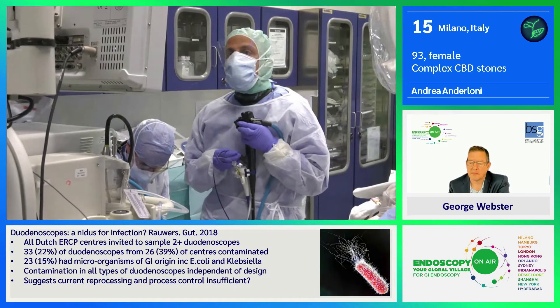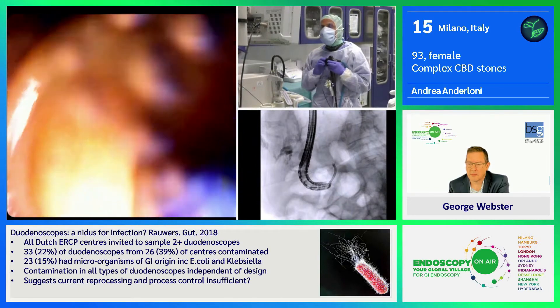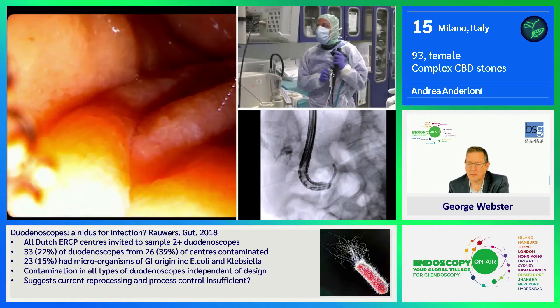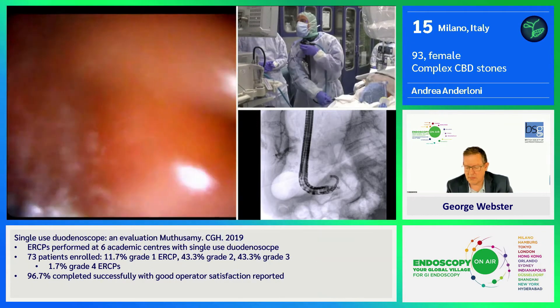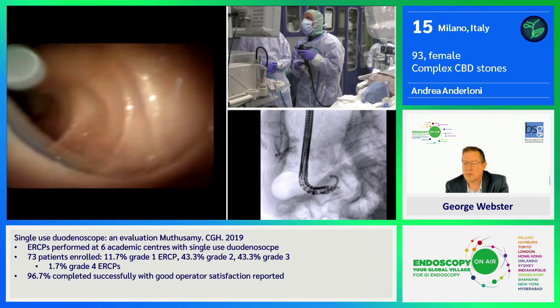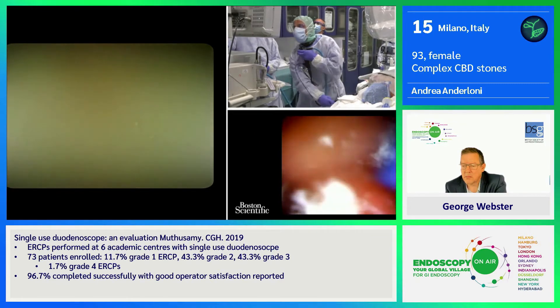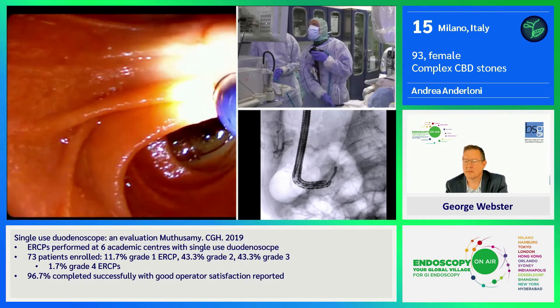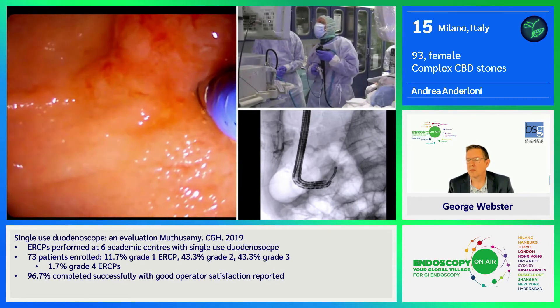I've already used the Exalt system to reach the duodenum, and with the Spyglass DS system I try to enter the bile duct with some water. Now I'm trying to get into the bile duct with the Spyglass system that, as you can see, can be easily used without a guide wire. This is my Spyglass scope that can be used as a scope or also as a catheter in order to reach the papilla.